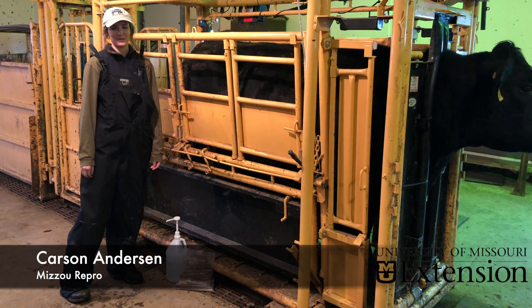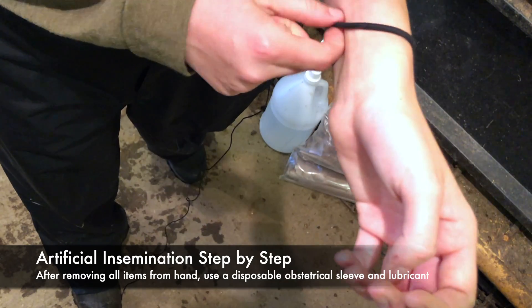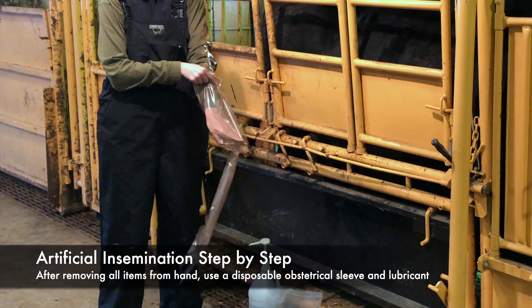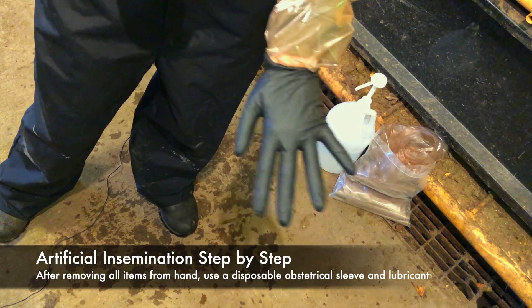Today we're going to go through a step-by-step process on how to AI. Make sure your wrists and fingers are free of any jewelry, watches, or hair ties. Use an OB sleeve on your palpating hand. Most technicians prefer to use their non-dominant hand. Some technicians prefer to use an additional glove on the outside of the sleeve.